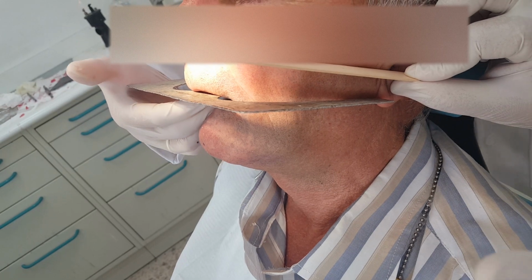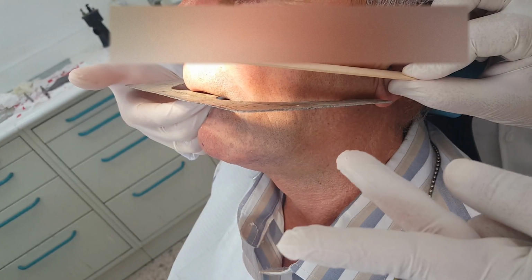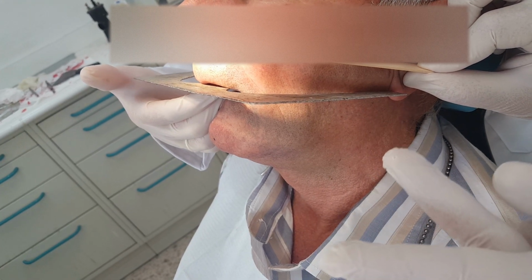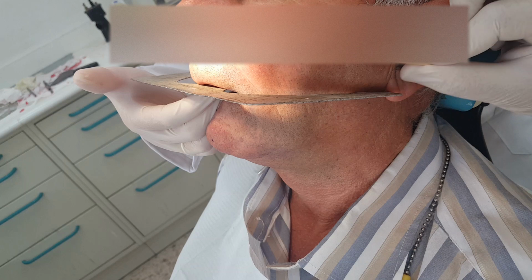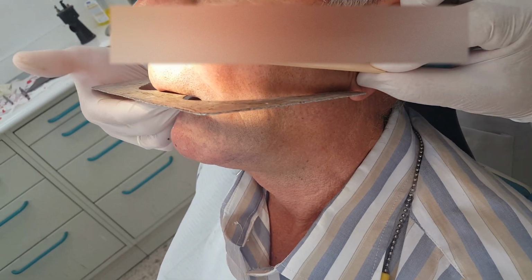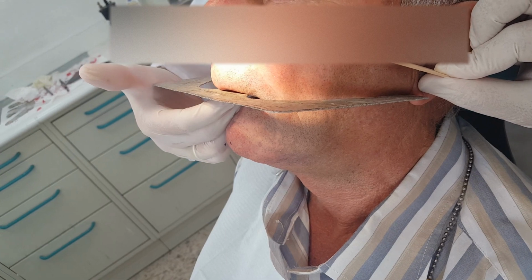In highly resorbed ridges, and in cases of large tongue, and in cases of patients that have a class 3 mandibular relation to the maxilla. These cases we need to lower. It's a must to go to the lower. Otherwise, I have the option. I could use the middle of the tragus or the lower of the tragus for my reference.